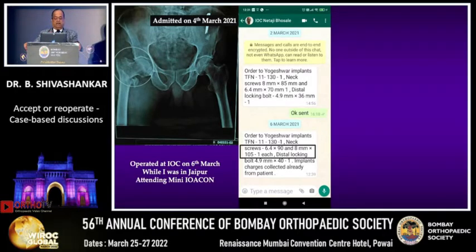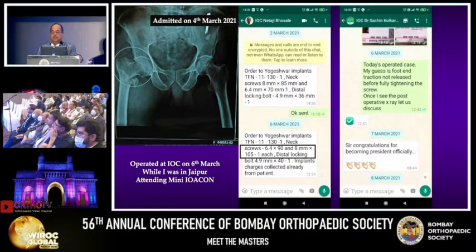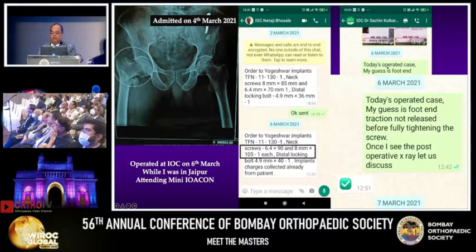This is another case — Sushruth, I'll ask you. This was operated while I was in Jaipur attending IOACON last year, at my own center. My OT assistant wrote to me saying 'please order 6.4 into 90mm and 8mm 105mm screw.' Does this give you any idea about how this case was operated? You can see the X-ray. I don't know why 105mm — that's too long. Immediately I wrote to the surgeon who operated. My guess is traction was not released before fully tightening the screw.